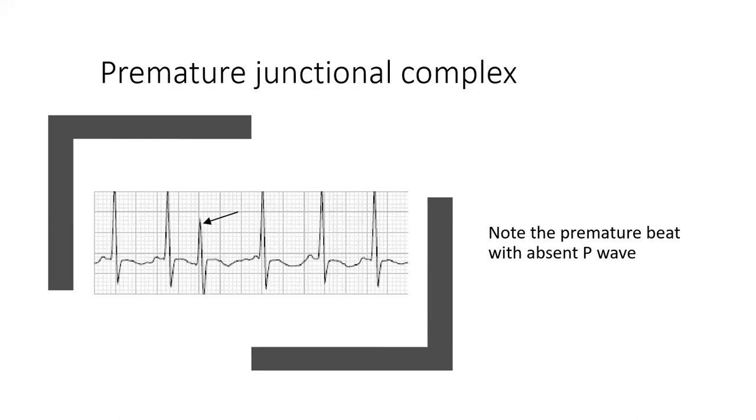Premature junctional complex, note the premature beat with absent P wave. So there's just a premature beat, but you don't actually see the P wave here.